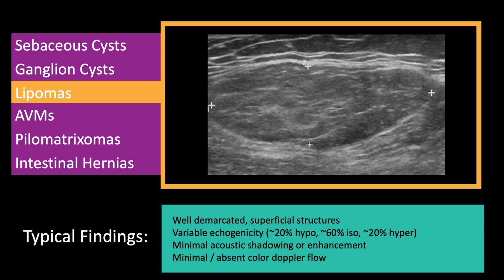I most commonly use POCUS not to diagnose lipomas, but instead to measure them when I'm planning for excision, to define my margins and to pre-screen for less common but scarier conditions such as deep lipomas, lipomas that have fixation to fascial or other structures, or abnormal vasculature that could be suggestive of a liposarcoma or else require a more extensive surgery and diagnostics.